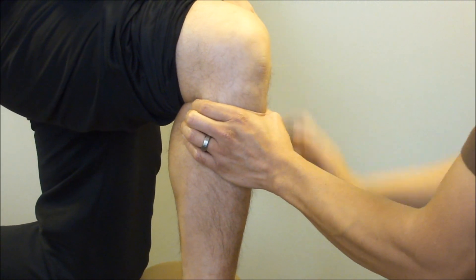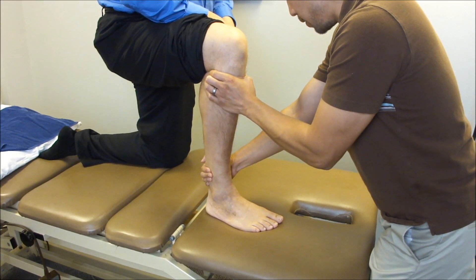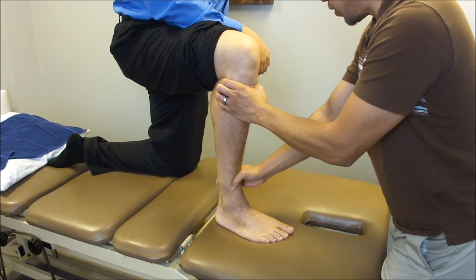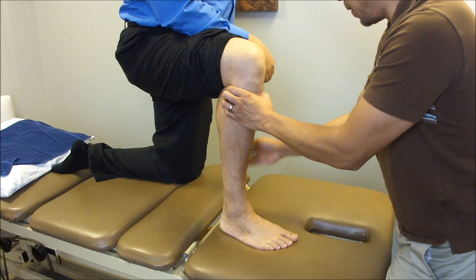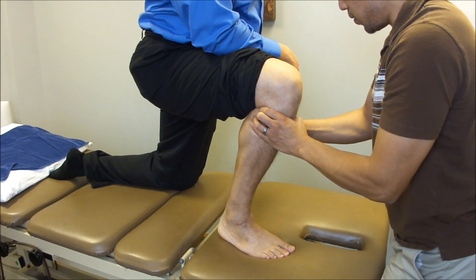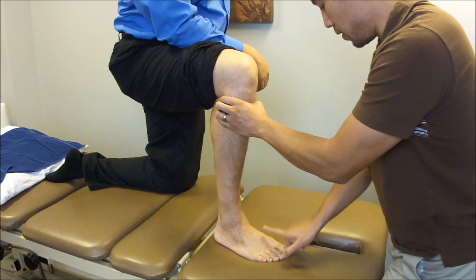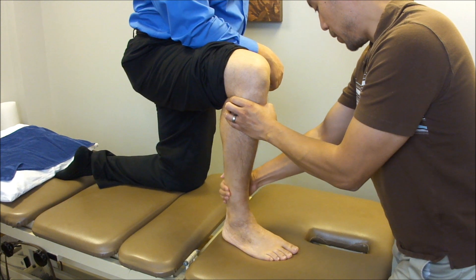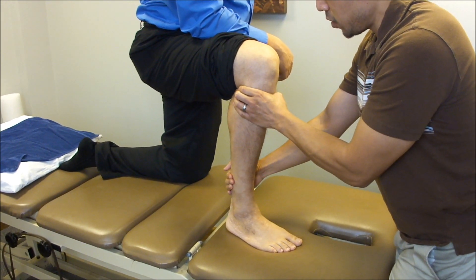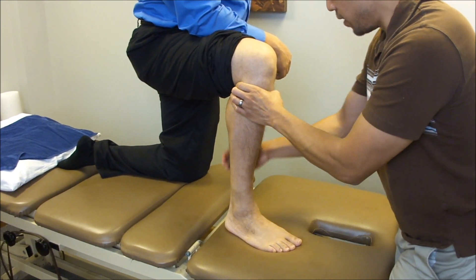My assisting hand is going to track the tibia and patella properly. When he goes into dorsiflexion, I want him to go in a straight line over the second toe, so I'm just helping track that and also doing a slight talar curl mobilization here as well. I'm going to use my fingers and squeeze to pull the fibular head anteriorly.